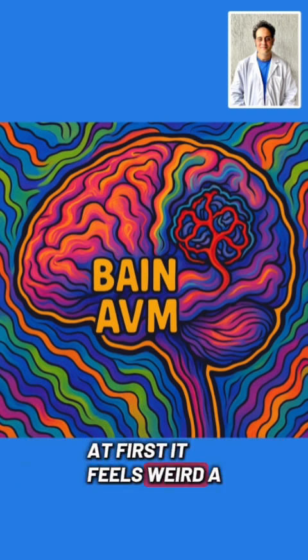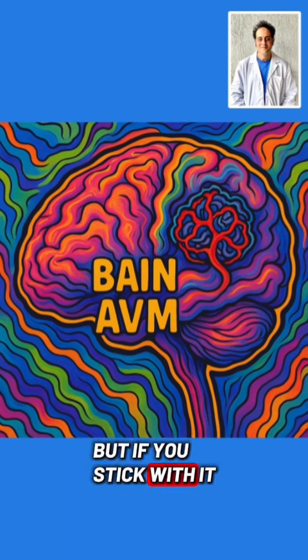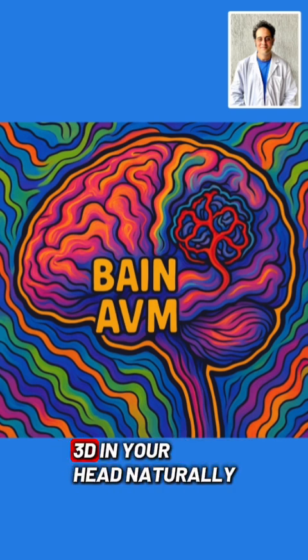At first, it feels weird, a little confusing maybe, but if you stick with it, I promise, it will click. You'll start seeing the AVM in 3D in your head, naturally.